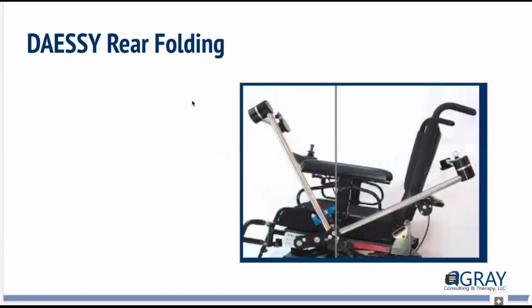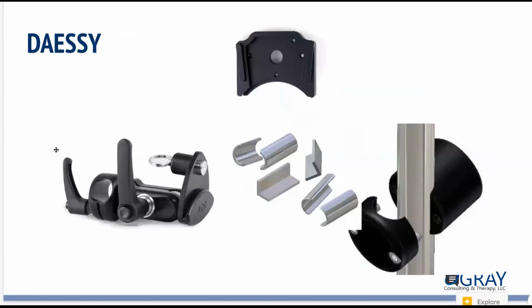So like on our previous slide, it just slid onto the bar and there was no adjustment. Pretty much every time I'm seeing an eye gaze user, I'm selecting this two-handled option if I'm mounting with Daisy, so that I have some adjustment, right? We were talking about tilting to match, rotating to match the location of the eyes. This can be really helpful. Also, it provides care support providers a way to make some quick adjustments without tools. I try not to hand tools out because sometimes the bolts get a little stripped.